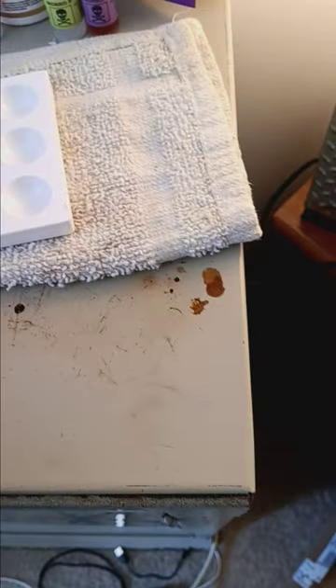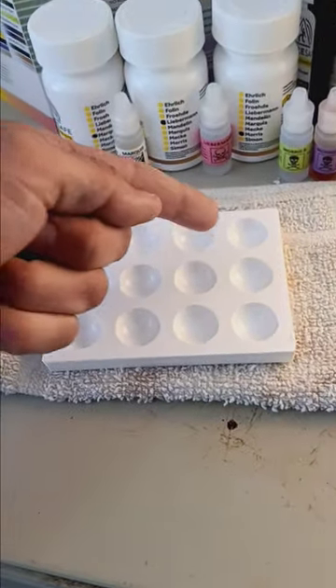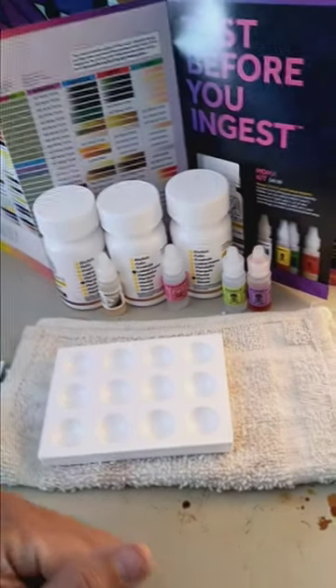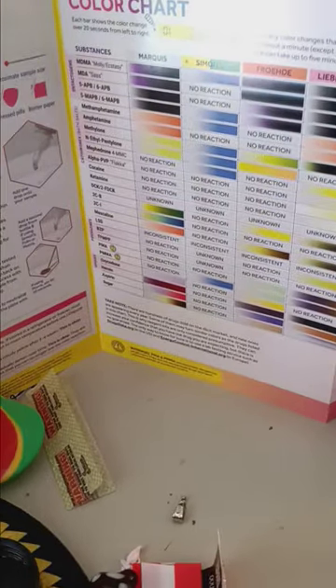Once you have that there, you're going to take your said substance — let's say a little dot like that, for example. You're going to take your cocaine, you're going to put it right here, there, there, or any of the spots you feel necessary. Then what you're going to do is look at your color chart for a second and see what you're going to look out for.